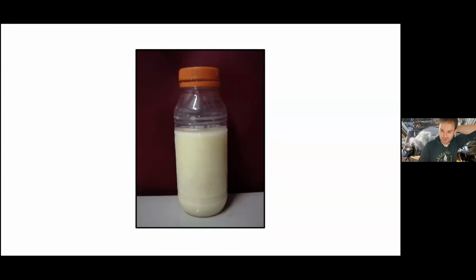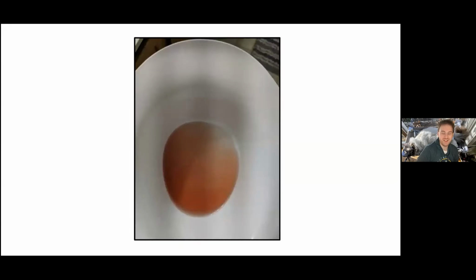Clinching the diagnosis. So this is chyluria. As I was reading about this, it's a kind of milky urine that comes out, and it can happen in filarial infections. How did it get down there? Exactly. I have no idea. I couldn't find more about it.